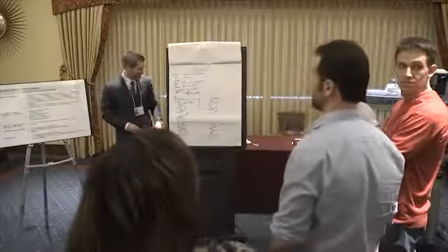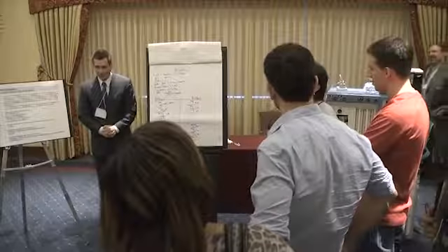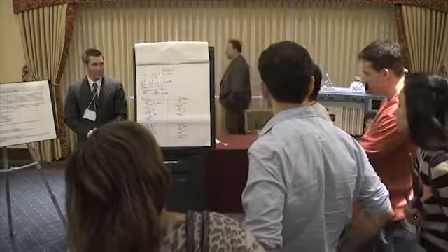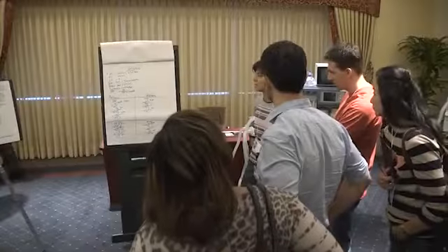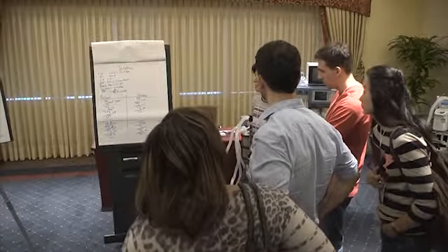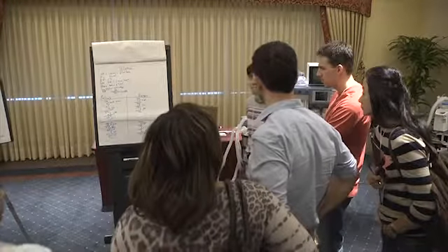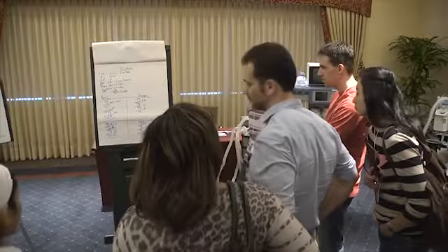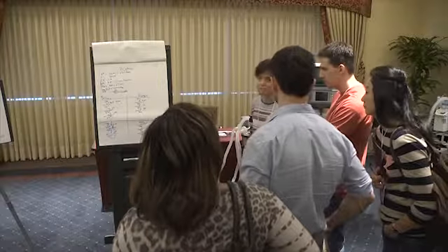Speed talk. Two keywords that we need to talk about: Mapleson D rebreathing. So as you know, there is rebreathing with all the Mapleson circuits. There is an APL valve. There are no unidirectional valves. And there is no CO2 absorber. So there is going to be rebreathing in all the circuits, right? The best that came out with it is Mapleson D because of the different configuration of the system, with the fresh gas flow being close to the patient and the APL valve being close to the bag. So there is less rebreathing in D, which is a modified version of A.